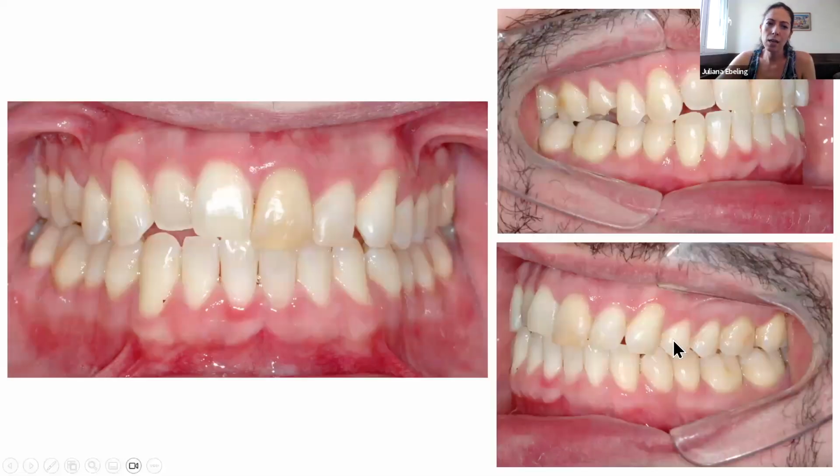And so this is a case. It was not only treated with aligners, but we had more here. We had ankylosis of some teeth, and it made this case very challenging and very difficult to finalize because we didn't have movements, and you see how we finished this orthodontic movement.